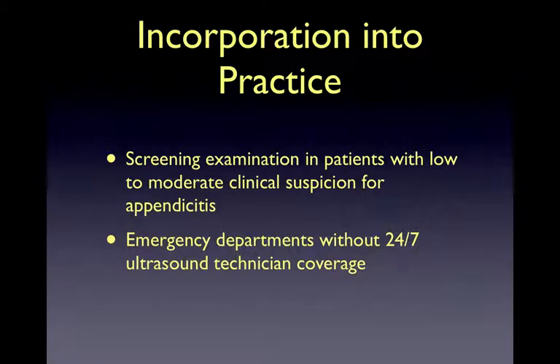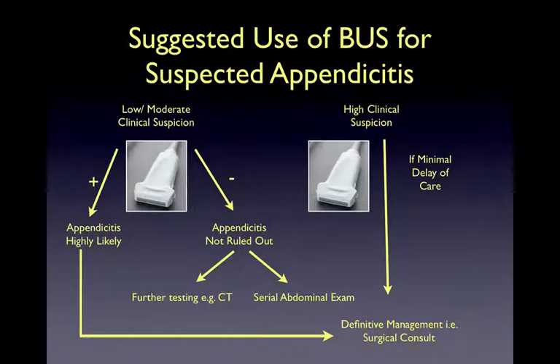In other words, bedside ultrasound can be used as a screening examination with patients with low to moderate clinical suspicion for appendicitis, and this is especially valuable in emergency departments without 24/7 ultrasound technician coverage.